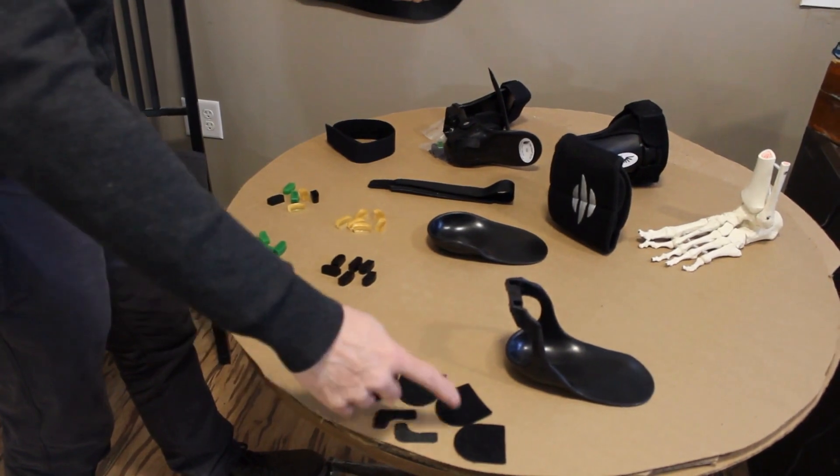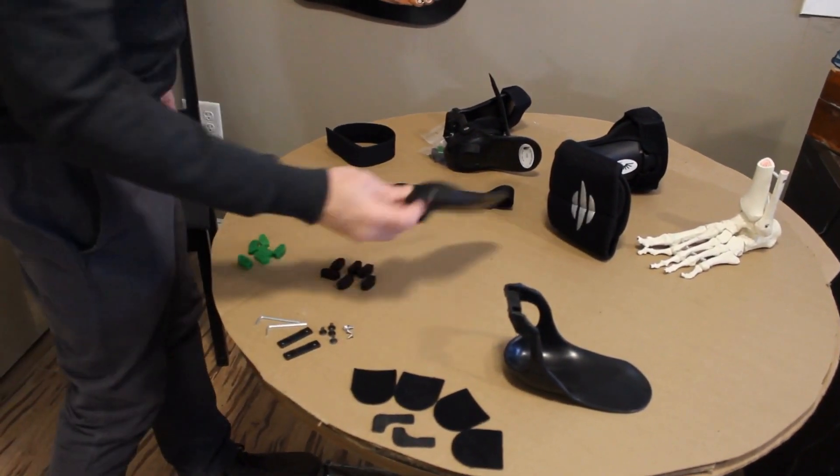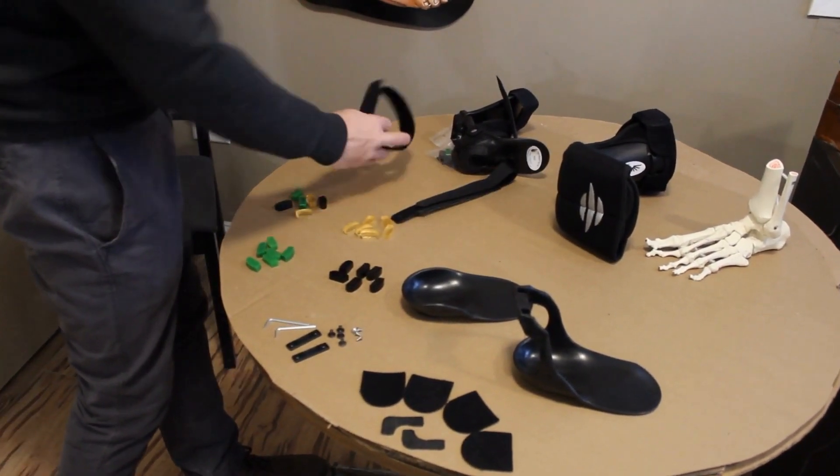This is a velcro kit, which allows you to velcro it into your shoes better. Here is the tip square, the eye strap, and the calf strap.